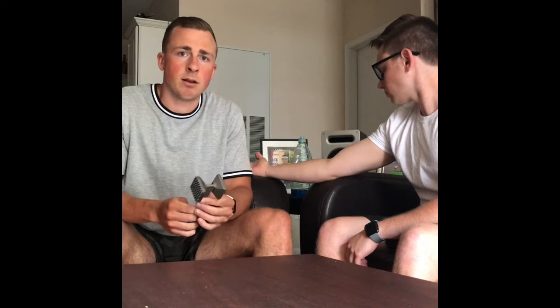All right, we have our patient Brett here, and he has some inflammation in the medial side of his elbow near the common flexor origin. So we're going to use phonophoresis and ultrasound in order to enhance the delivery of a topical med, dexamethasone, in order to reduce the inflammation in the local area.